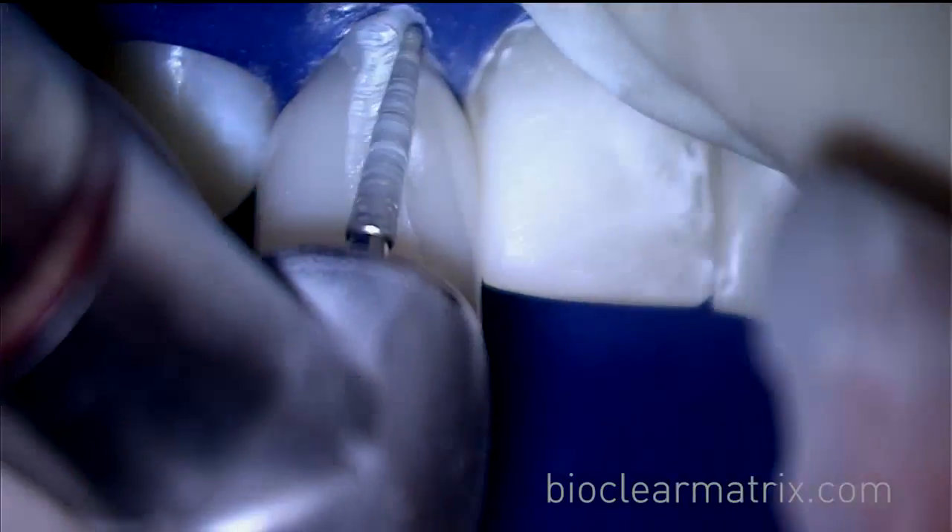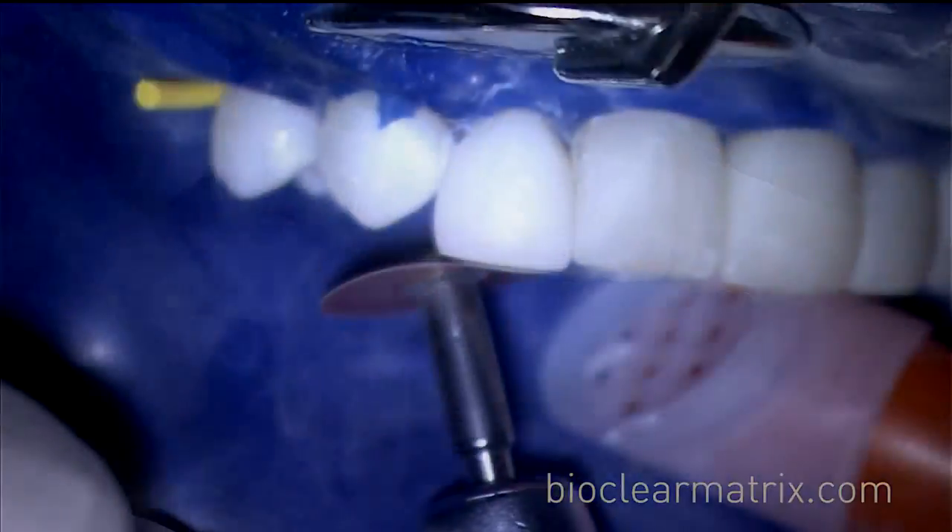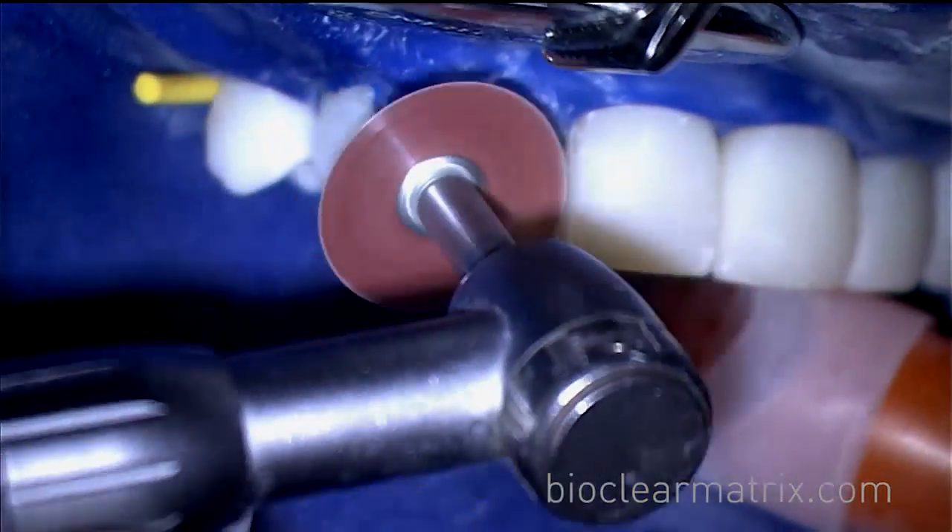After your gross contouring is complete, using your coarse diamond and disc, you'll start the three-step polish.